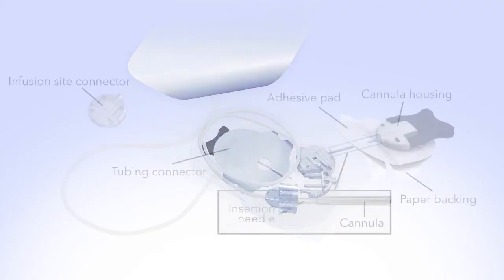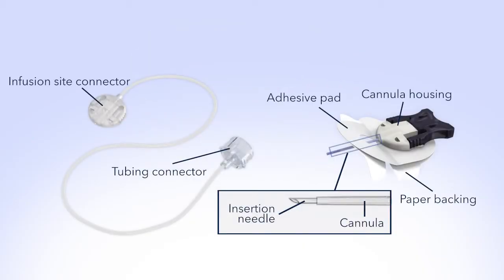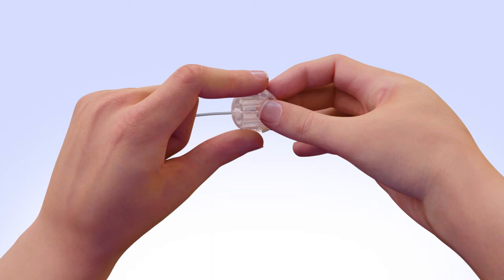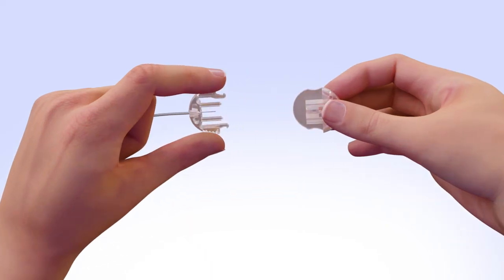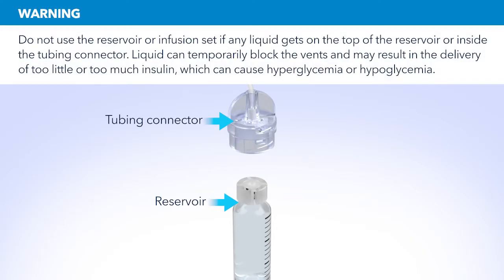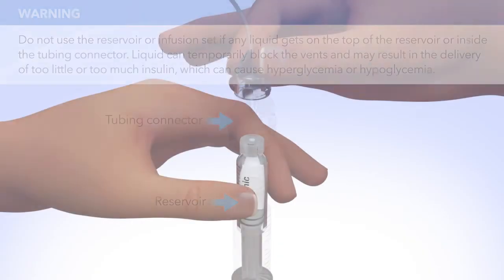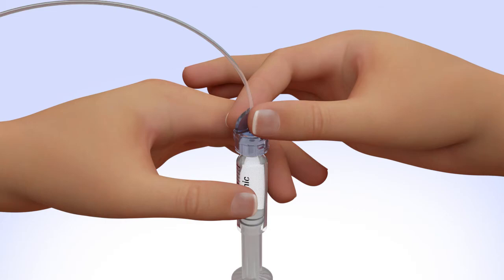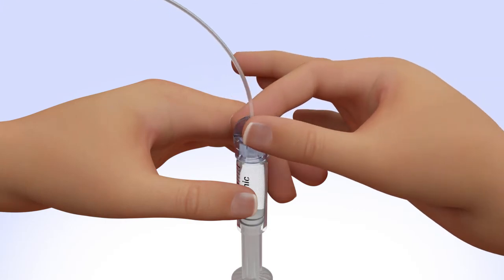Remove the infusion set from the package. Remove the protective cover at the end of the set release by gently squeezing the flexible arms on both sides, and then pull it away to expose the connector needle. Make sure both the top of the reservoir and the inside of the tubing connector are dry before connecting them. If any liquid has gotten on the top of the reservoir or inside the connector, start over again with a new reservoir and set. Hold the tubing by the connector and place it on the top of the reservoir. Find the right position by turning and gently pushing the tubing connector until you feel it slide smoothly in place. Turn the tubing connector clockwise until the reservoir and tubing connector lock with a click. The tubing connector should not be loose or come apart from the reservoir.